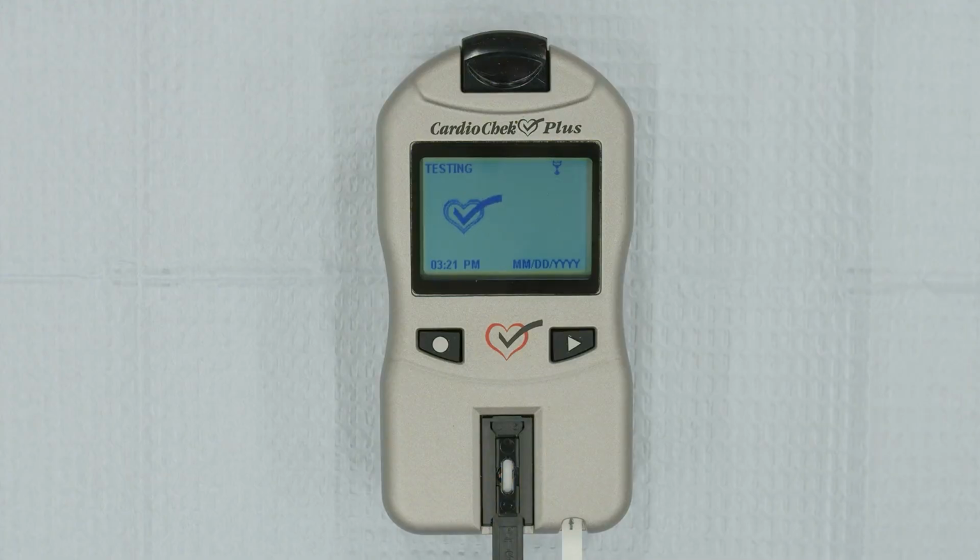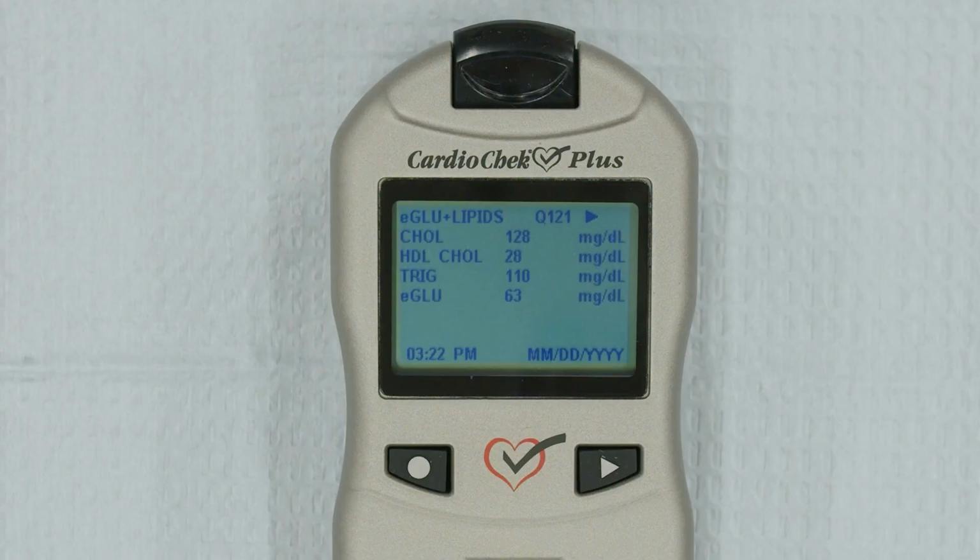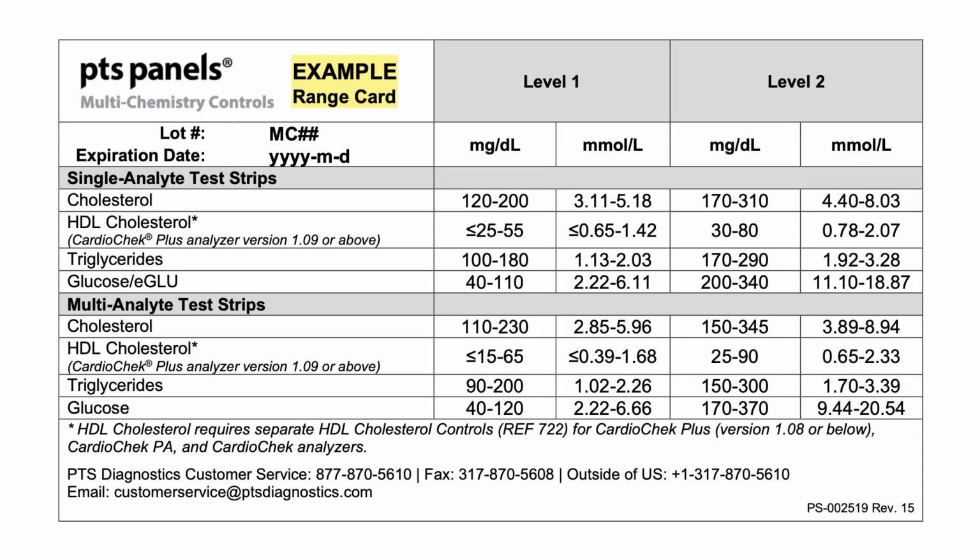The analyzer will automatically begin testing and will return results in as little as 90 seconds. Do not move the analyzer while it is testing. Once the results appear, check your range card to see if your results are within the specified range.